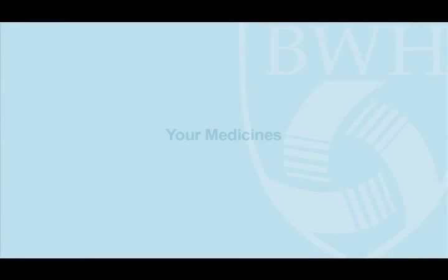Your medicines. Having a pacemaker means that you must know your medicines and take them the way your doctor tells you to. Make sure you carry a list of your medicines in your purse or wallet at all times. There is a medicine card in your discharge folder for you to use. Tell your dentist and other doctors that you have a pacemaker.